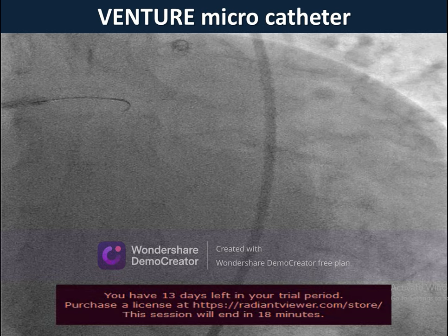So there is a straight way between the LAD and LCX, and also this way is so wide. So you're losing the contralateral support of the vessels to help the pushability of the wires to penetrate the proximal cap. That was the main reason why the first trial failed.